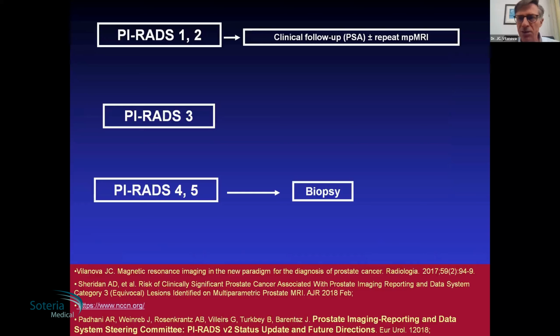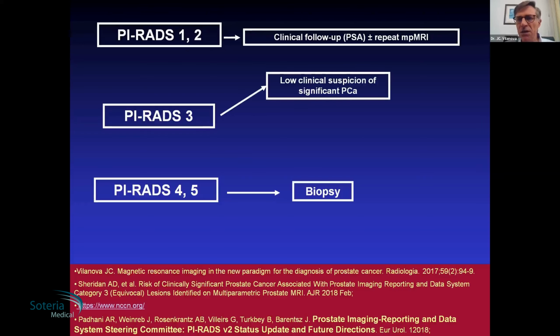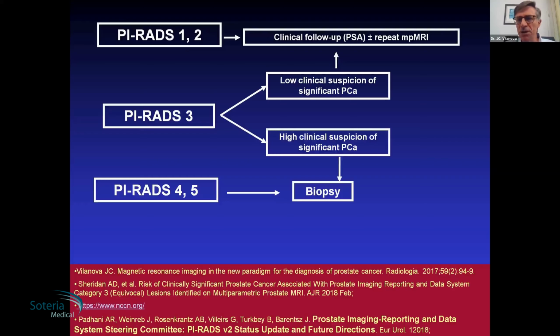What about the PIRADS 3? Well, this is the challenge. But here we have more data with the patients, because the same image on a PIRADS 3 has different management. Why? It depends on the patient. I'm not going to have the same management with the same PIRADS 3 score in an 80-year-old patient with previous negative biopsies and a low PSA density. This patient, even if I'm not sure that it's a discrete signal intensity, I'm going to follow up. The same PIRADS 3, the same image, in a 50-year-old patient without any biopsy, I will recommend biopsy. So, same image, different management.